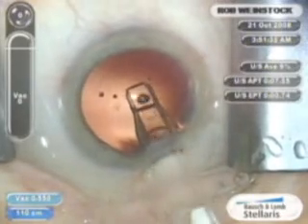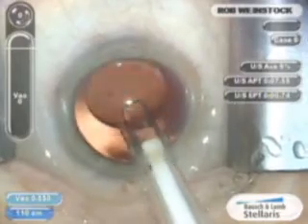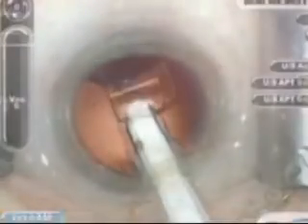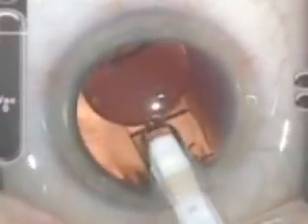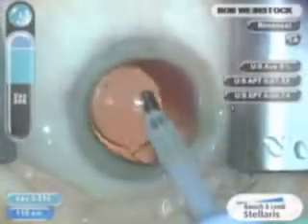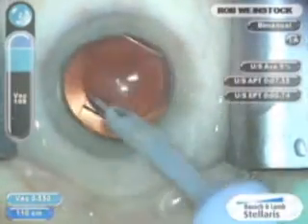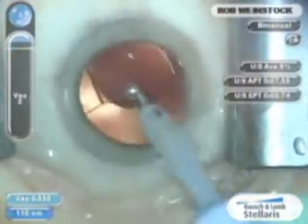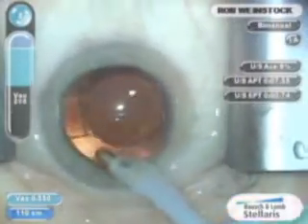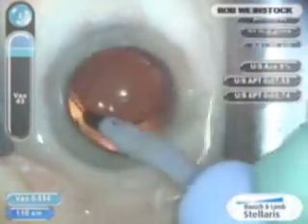The plunger style delivery system is used with a single plunge to deliver the leading haptic and lens into the eye inside the capsular bag. The CrystalCert injector system has improved the delivery of the CrystalLens HD implant with its one-handed plunger style delivery system.